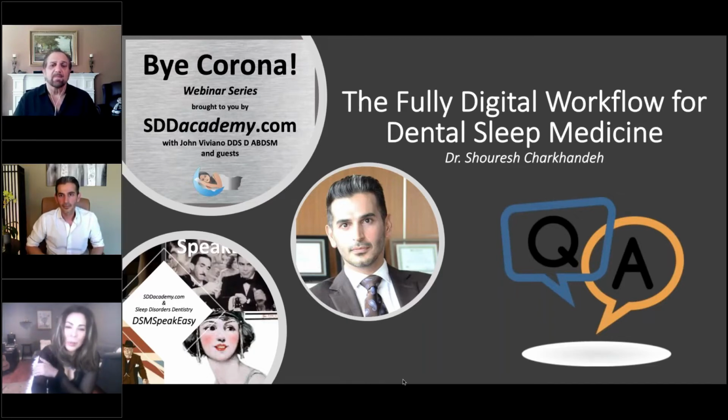Thank you. The next one is from Lane Martin. He wants to know, where can you get the digital bite fork and what protrusive mechanisms are you using? George gauge, Andra gauge, etc. The bite fork, I know it's available through Zephyr Sleep Technologies as well. If you go on their website, they sell them. They're the plastic ones, so they don't break. ProSomnus also sells them. Just make sure you specifically ask for the ones that I use. They're called digital bite forks. It's not a big deal.